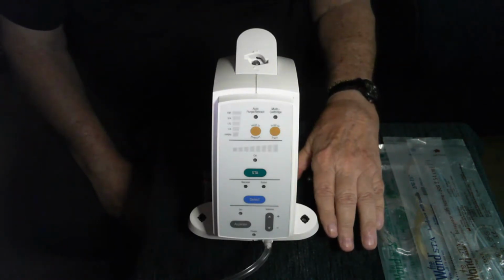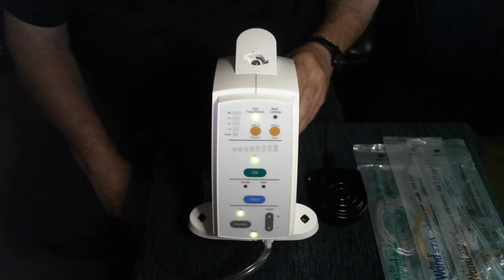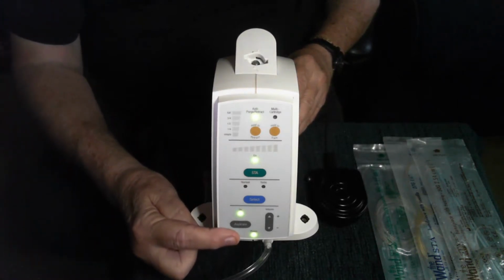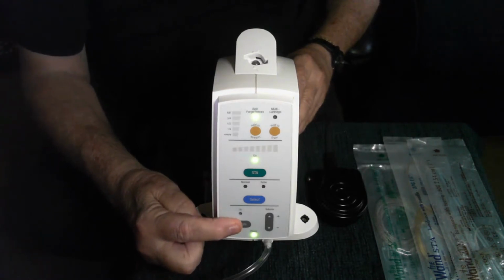So when we turn the instrument on by hitting the switch in the back, as you can see, some lights come on. The first light is just the power light at the bottom. The aspiration light can be turned on or off.